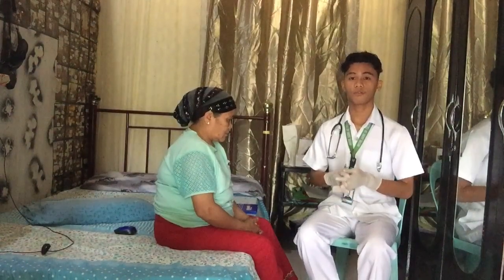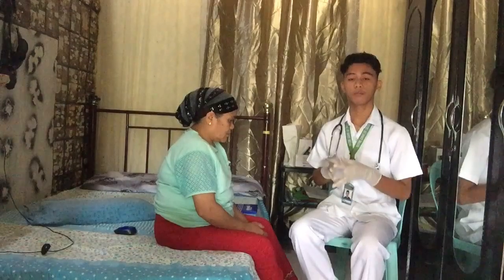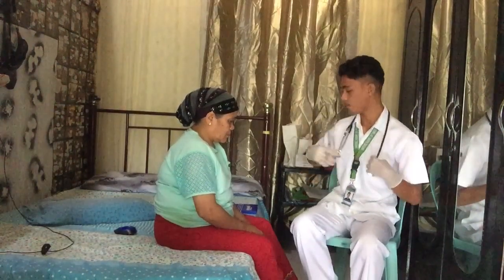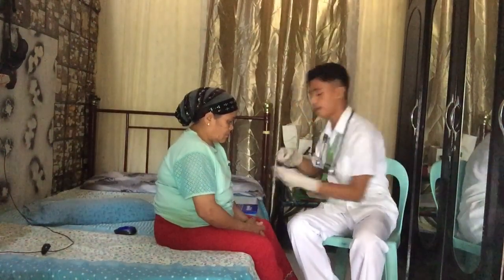BSN1 student of Notre Dame of Tacloban College, and this is my grandmother. Today we're going to continue our demonstrations on head-to-toe assessment. Equipment to be used: stethoscope, pen light, and tongue depressor.